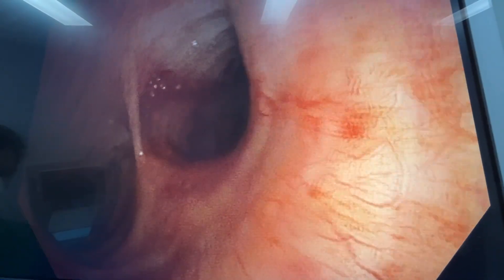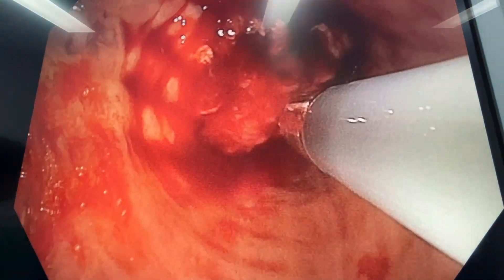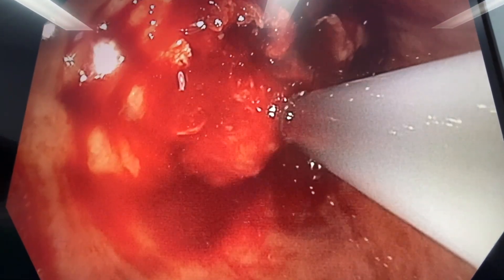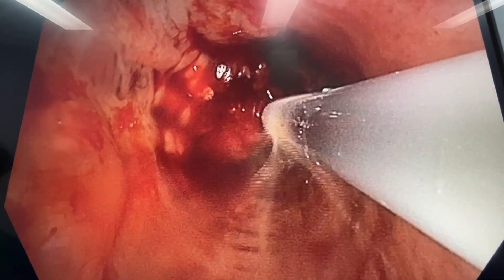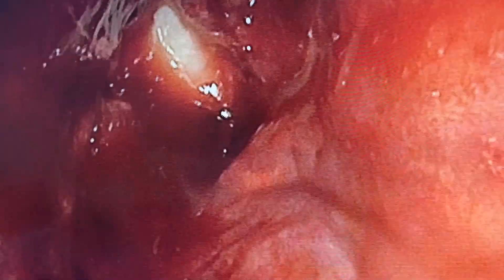The next step is to have a look at the residual tumor. You can see there's still quite a lot of residual tumor, so I'm going to use the cryoprobe now just to take large pieces of this at a time to try and resect as much as possible. I've done multiple of these cryodebridements and there's still quite a bit of tumor there, although I have removed a large amount. There's still some more to remove to get patency of the left upper lobe and left lower lobe.